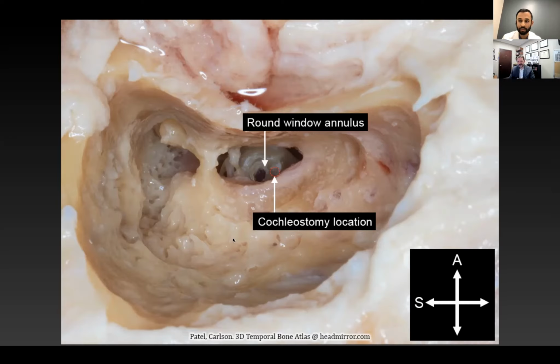The facial nerve at the second genu is never lateral to the lateral semicircular canal. As you move inferiorly towards the stylomastoid foramen, it can start coming out laterally. Everyone's different. Sometimes it's at the same plane, and sometimes it comes out more laterally, but you want to lower it to about that level. That's what I would call setting yourself up, preparing for the facial recess.